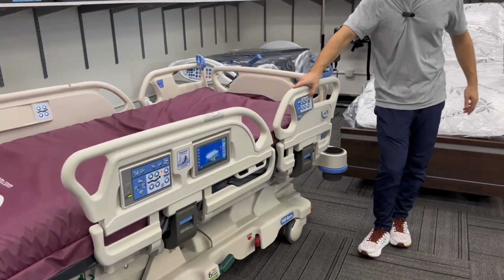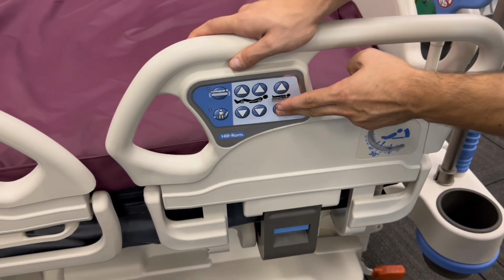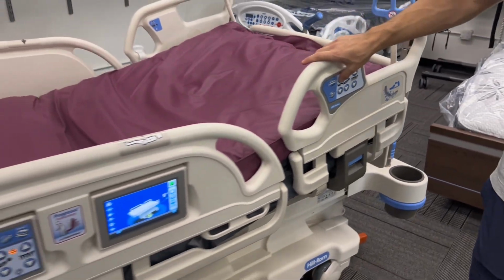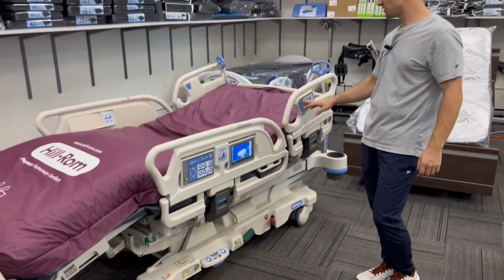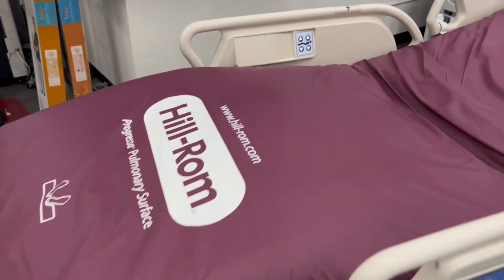On our top railing here, we're going to have our buttons that again are exactly identical on the opposite side. So we're going to have our buttons for our height adjustment, head raise, knee raise, as well as two separate buttons for our mattress inflation if we're sitting on the mattress or laying flat on the mattress. So two separate modes that adjust that.